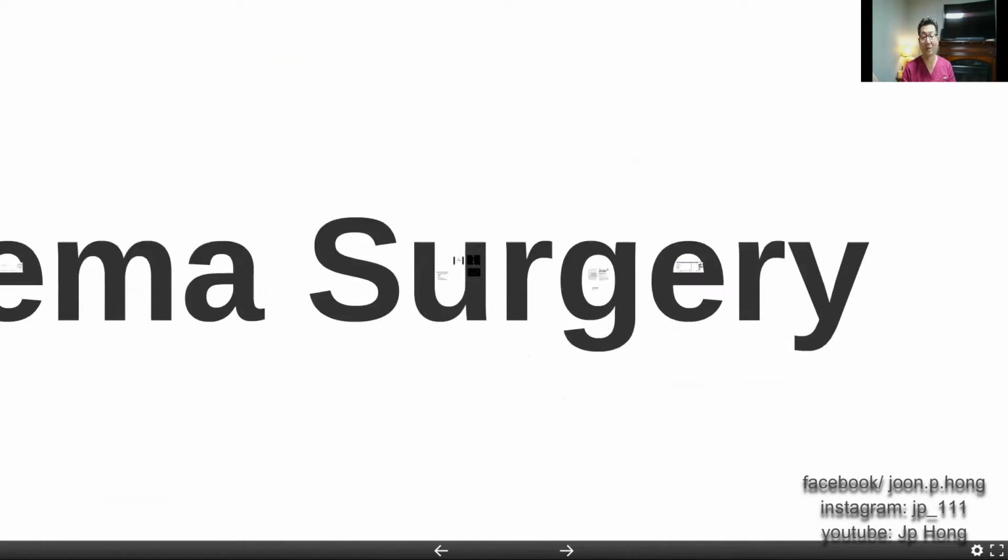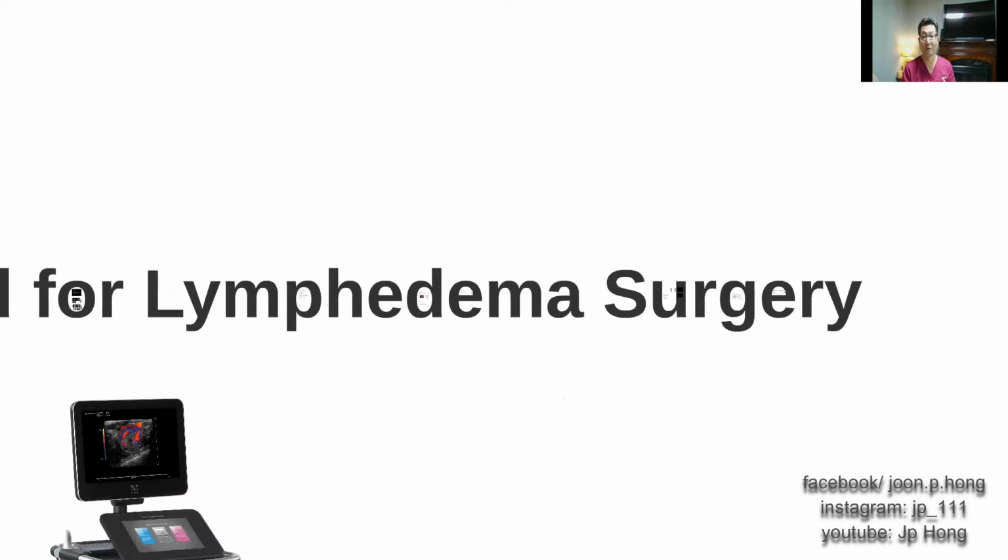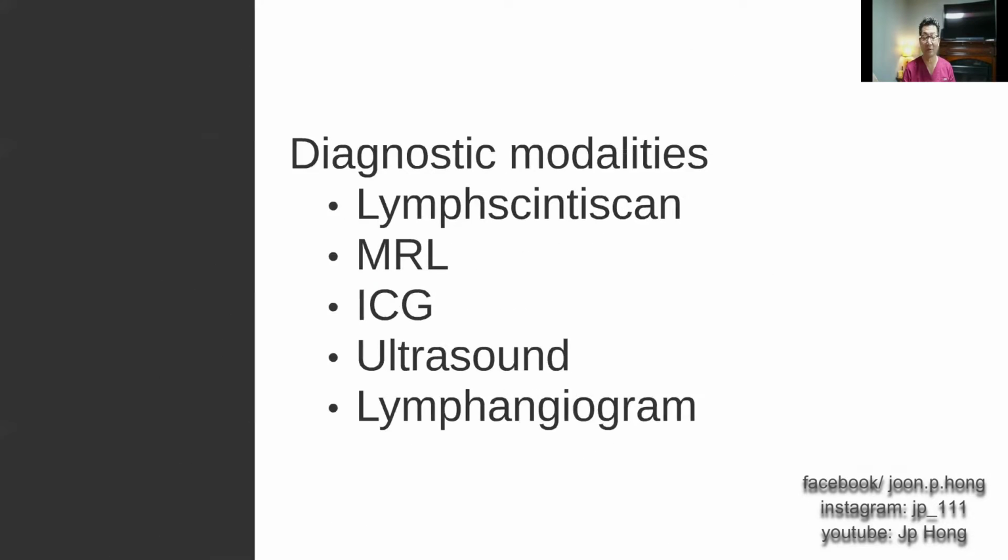So the use of ultrasound has really taken over for us as a major diagnostic modality for the perforator flap reconstruction, especially in the lower extremity. Now, how is that translated or transformed into the lymphedema surgery?